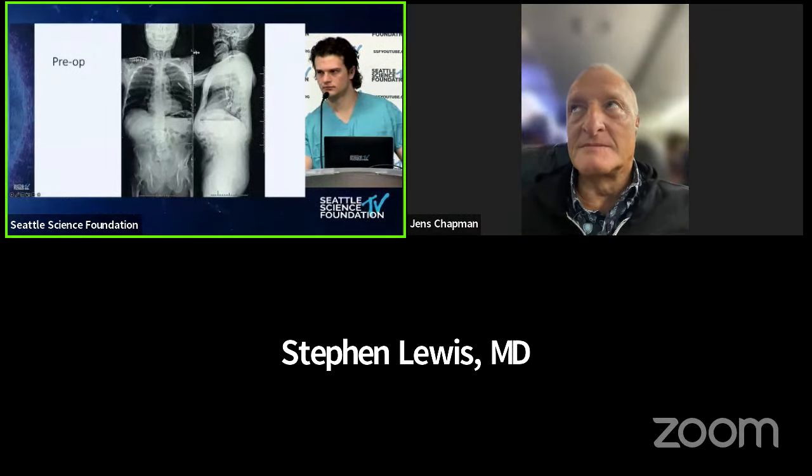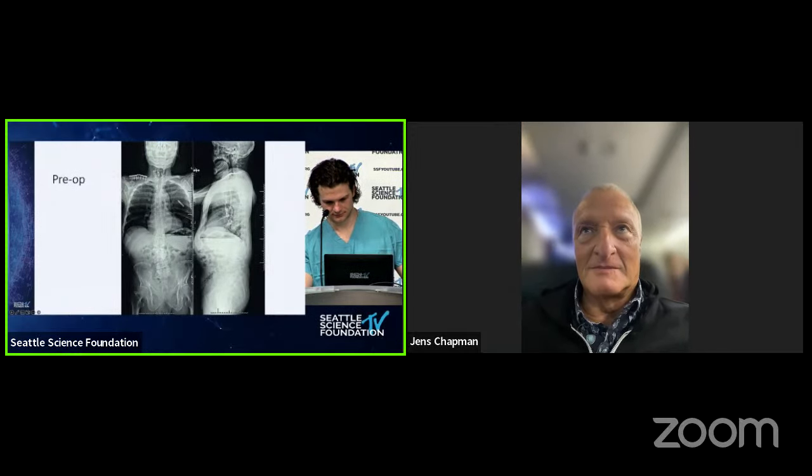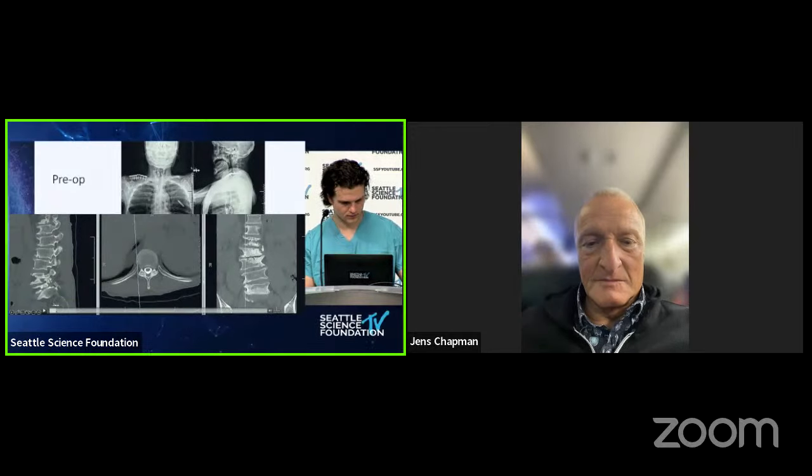Yeah, I know. I'm sure he had extensive. I was just trying to put David on the spot. If you look, I think he's got pretty significant. I think he had a pars fracture, grade 2 spondy. If you pull up the CT scan, these are difficult cases because I don't think you can just do a 1-level fusion on this.